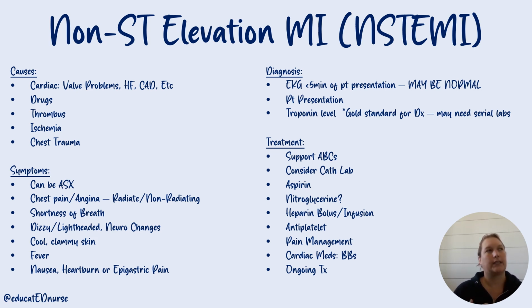So this could be the patient that comes in, my symptoms started 30 minutes ago, I'm having 10 out of 10 chest pain, my EKG looks normal, my troponin is pretty normal. This would be the patient that you would want to repeat your EKGs on and repeat your troponin in a few hours. If it's elevated after a few hours, they've got an NSTEMI. Or if their EKG is normal, they have these terrible symptoms and their troponin is elevated, they're having an NSTEMI. All right. Now, their troponin could be elevated for other reasons, but for the most part, if they come in with a cardiac presentation, that would be something to worry about.